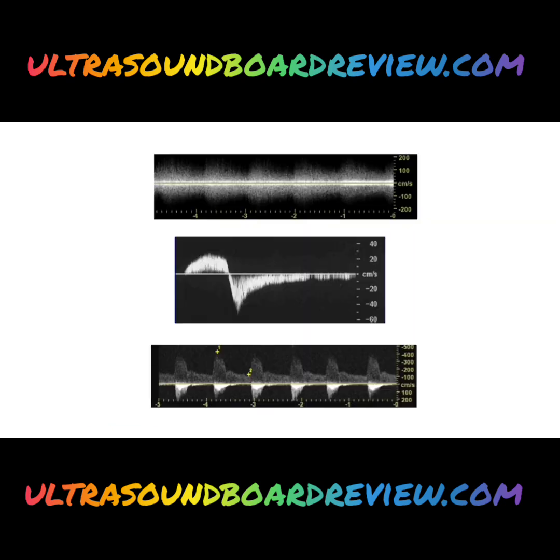All right, here we have some spectral Doppler waveforms. So let's figure out how to do this. Instead of finding where our probe is, or using the color of the vessel and matching it up to the color bar, we're going to use the spectral waveform and match it up to the positive or negative velocities. This might sound confusing, but don't let it be. Just flow with me here, okay?